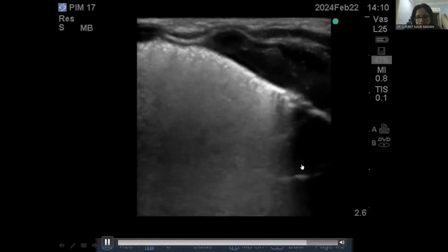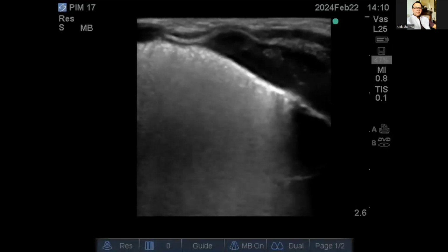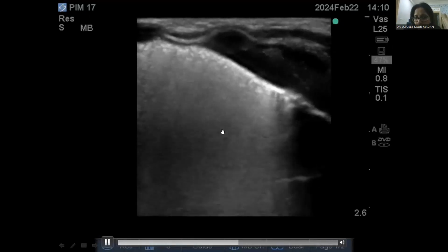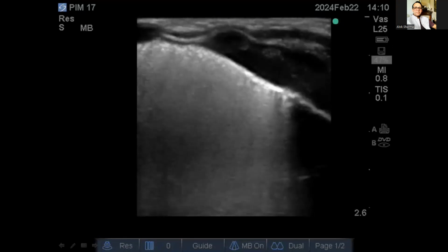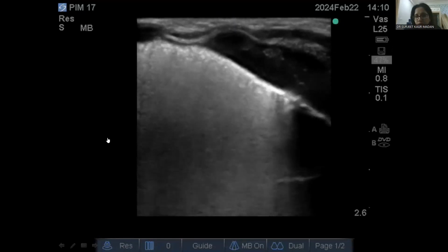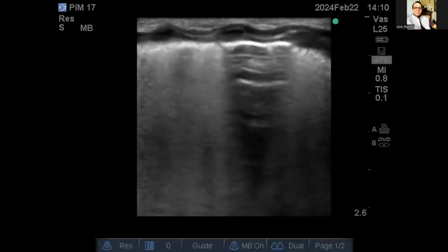Very nice. I'll score it as 3 in R1. Yeah, between 2 and 3. 2, I'd probably say. I'm not clinically convinced you have a lot of atelectasis there. You have a snowflake appearance with a kind of a whiteout. Yeah. So this whiteout can be seen in score 2 also. There needs to be atelectasis to call it 3. That's why some people have introduced a scoring system with 5 categories, to try and make it more sensitive. But I wouldn't worry, because if that's what you can see everywhere, your score will hit more than 9 easily. So don't feel too stressed about confusing 2 and 3.